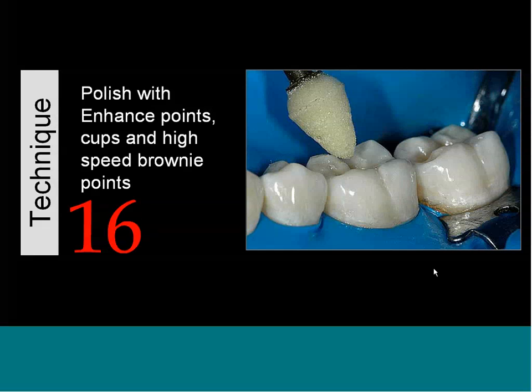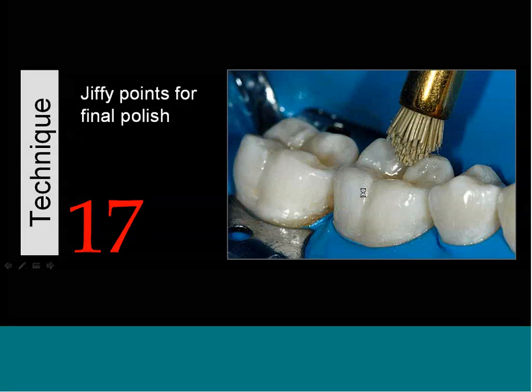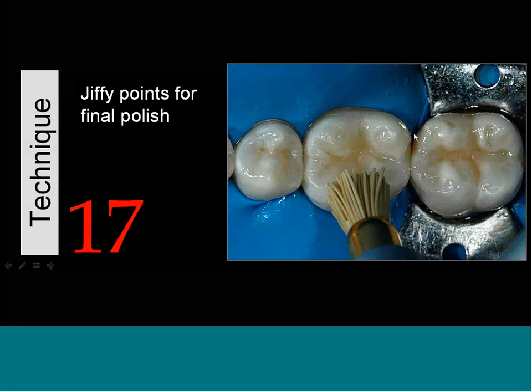And you can do the basic polishing with something like an enhance cup or point. Brownie points are great for finishing up. They're wonderful because they'll take just a microscopic amount of enamel down, as well as composite. Some other things are too aggressive. They cut away enamel or composite as well. And then we're going to use some jiffy brushes to get these shined up. The pointed ones get down nicely into the grooves, and the flatter ones will get more to the outside of the preparation.